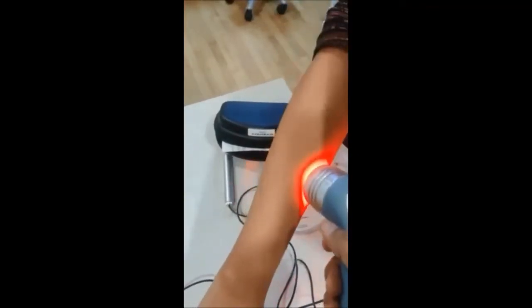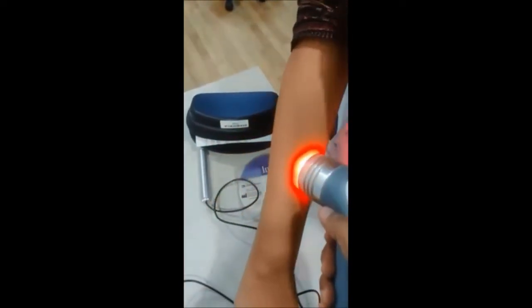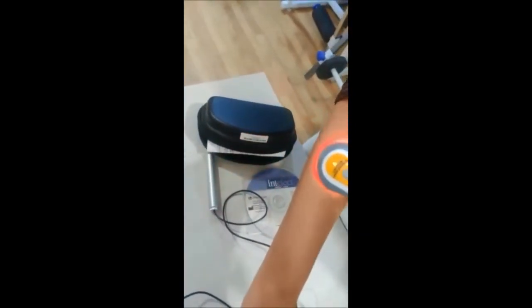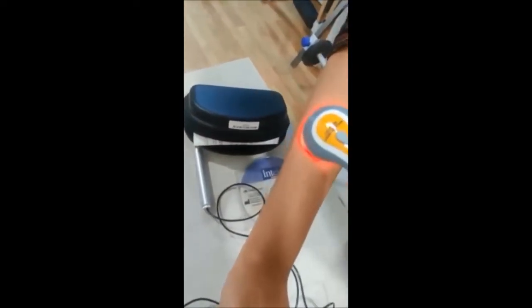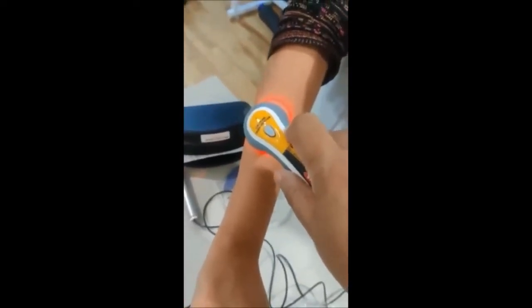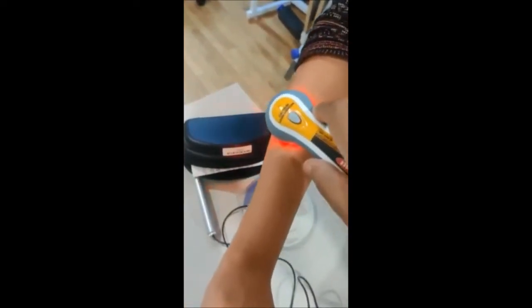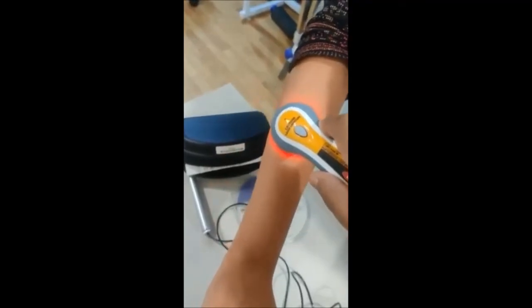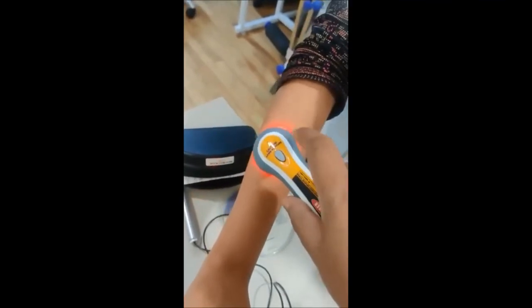Now you can see the treatment. It should be fully touching the skin. You have to move it — you can move it, or you can keep it at a point. You have to move it slowly. Once the treatment is over, the light will stop automatically.